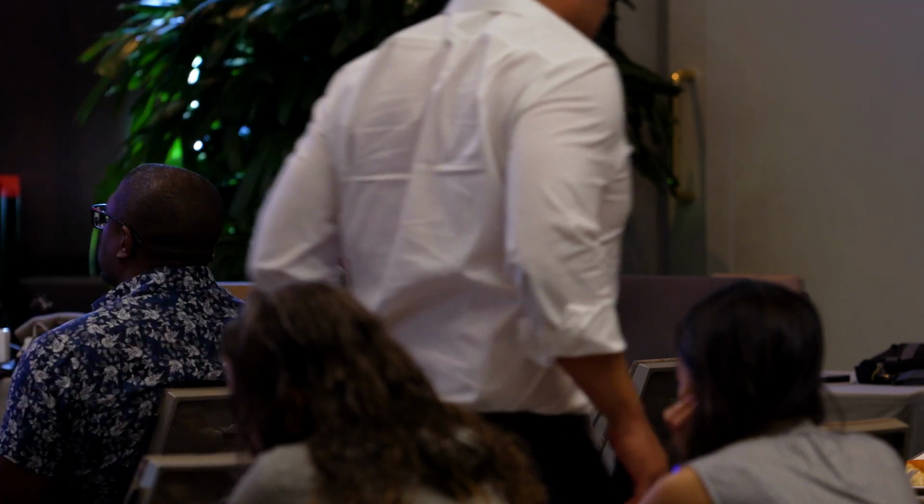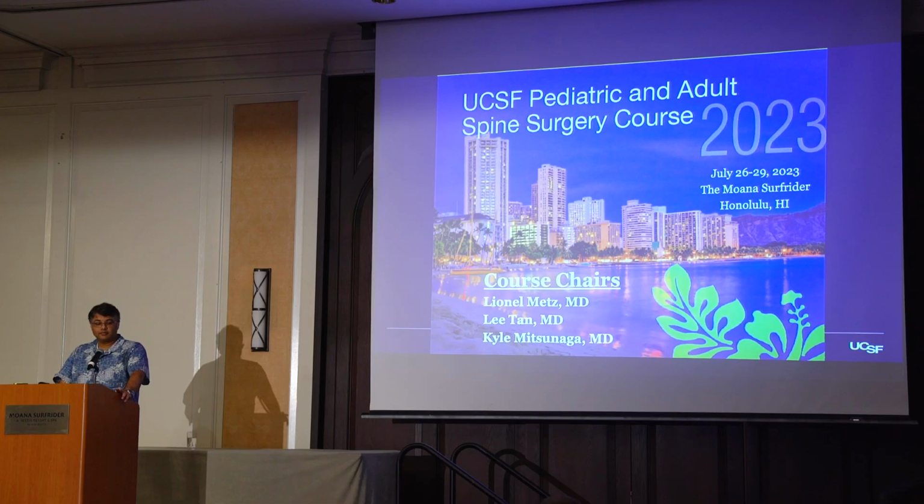And the other thing is that, something that Vince Trinalis mentioned at this meeting last year is that for C1-2 fusions, in China, they've been doing just instrumentation, maybe some posterior graft, and then going back once, in a year or so, once the dens is healed, just take it out, and then people kind of regain their rotation. I don't know, what's your opinion, or have you tried it in practice?